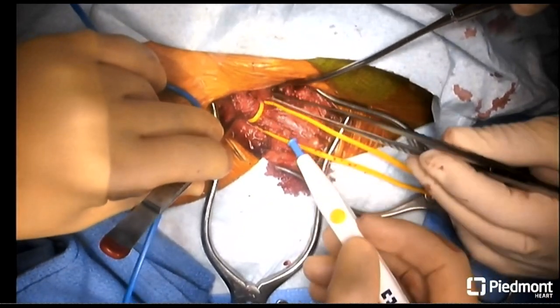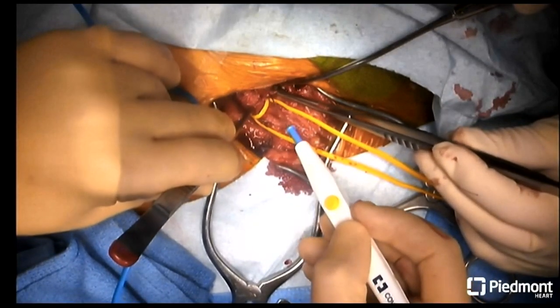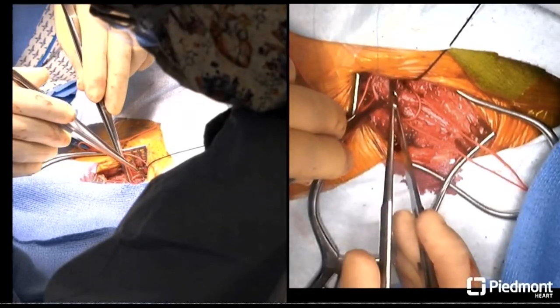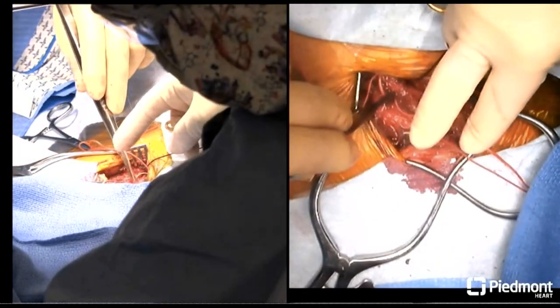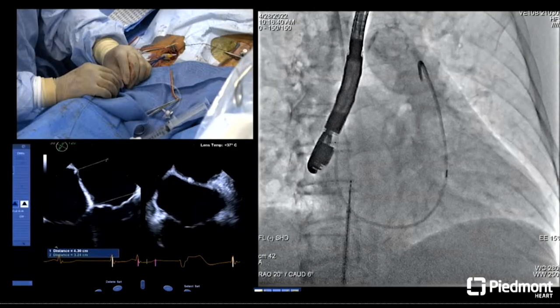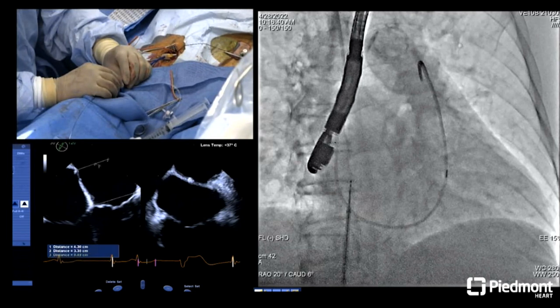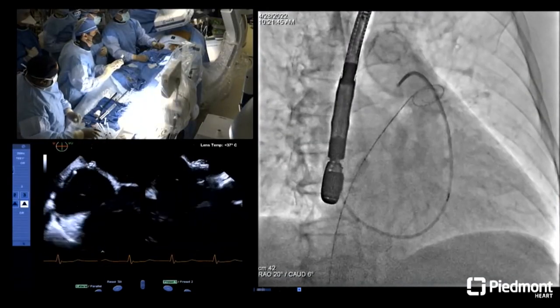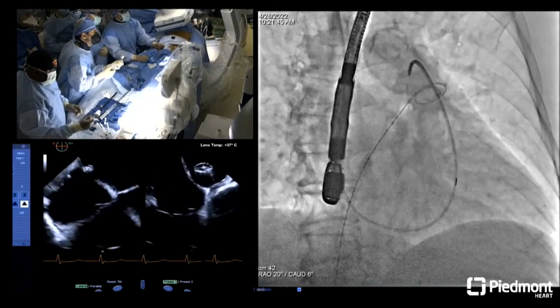And as I mentioned, there was an aortobifem bypass that was also repaired, a lot of scarring tissue, so a lot of careful dissection there, and then stitches on the femoral vein. Access with a regular needle and wire through this. And on the echo, you can see we're measuring the transseptal height. For this device, you want at least 4 centimeters transseptal height. You want to be superior in the fossa. And just balloon with a 10-millimeter septostomy balloon.